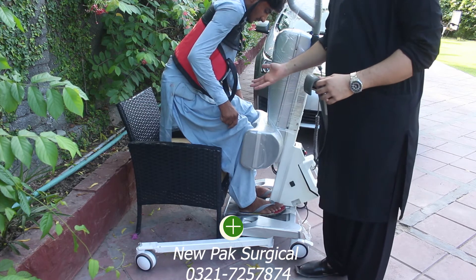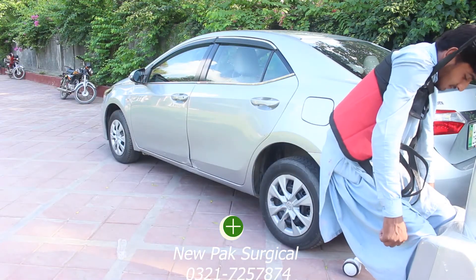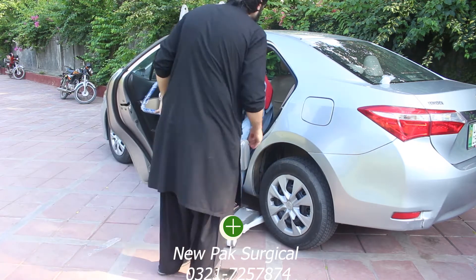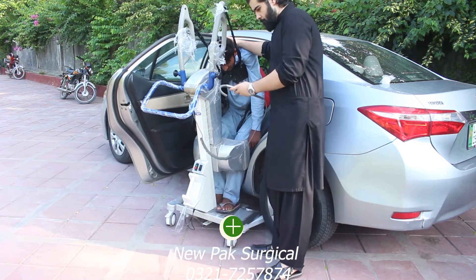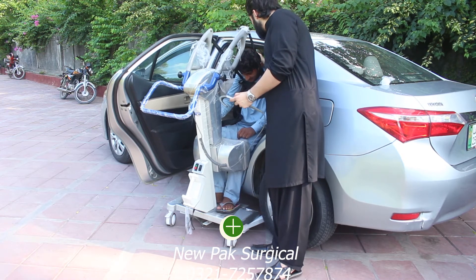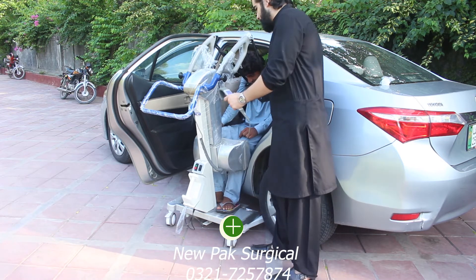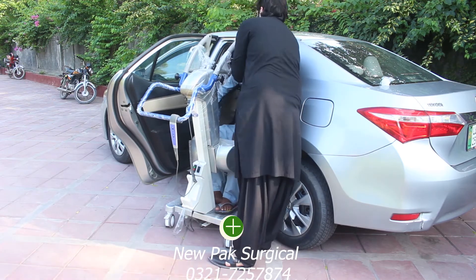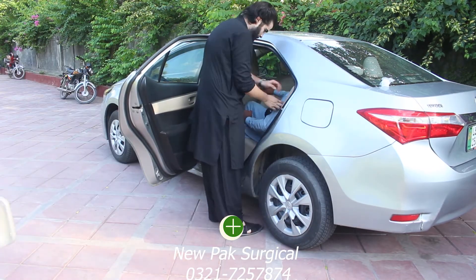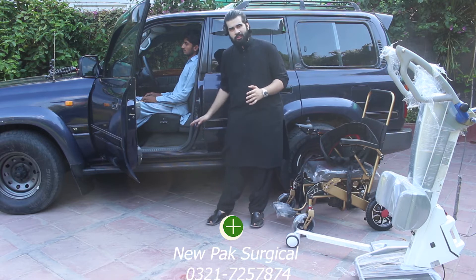As you can see, the patient is removed from the seat. Now we can move them through this. Okay, now let's assume that you have to take the patient out of a car, so you have to manage the ground clearance from the ground.